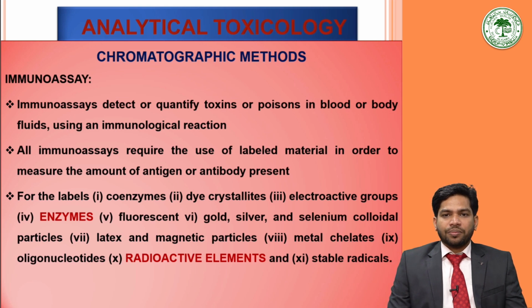For practical purposes, mainly radioisotopes and enzymes are commonly used for labeling. And so the technique of immunoassay takes its name according to the labeling done: ELISA, that is enzyme linked immunosorbent assay, and radioimmunoassay.